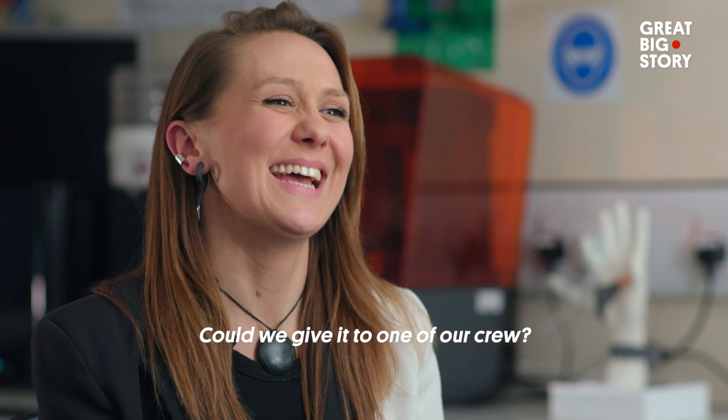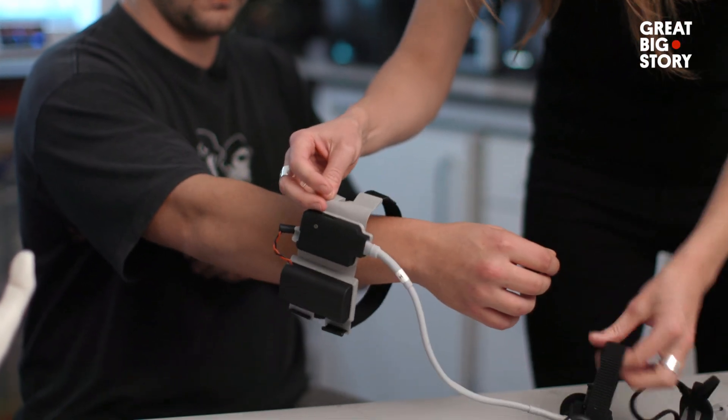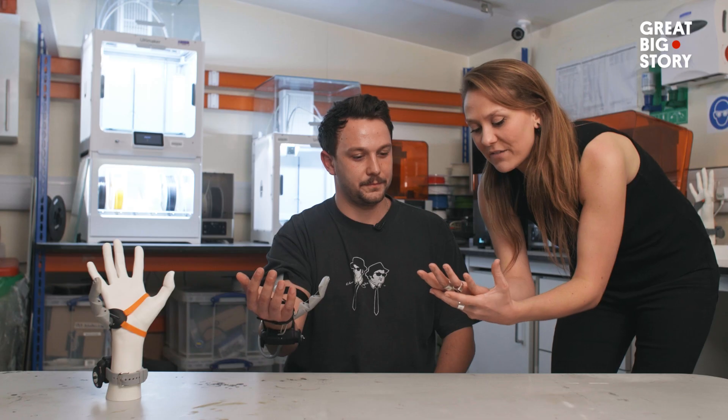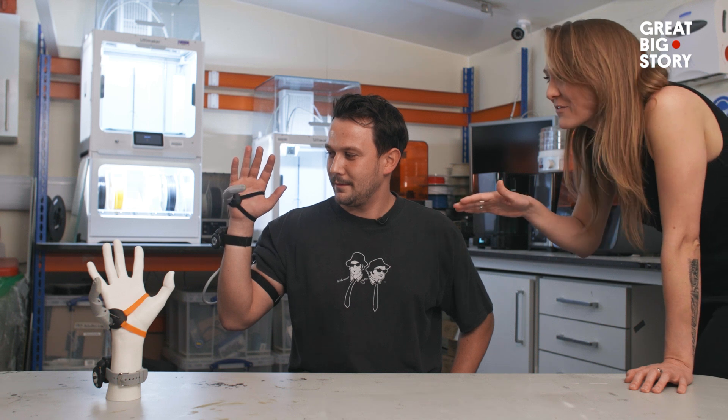Could we give it to one of our crew? Yes, absolutely, your crew member can try one. Cool, we're putting a third thumb on you today. Your left foot is going to control the up and back, and your right foot is the dominant foot — it's going to control the across and back. Yeah, there you go. You're doing great. This is still the first minute of use. I feel like a natural!